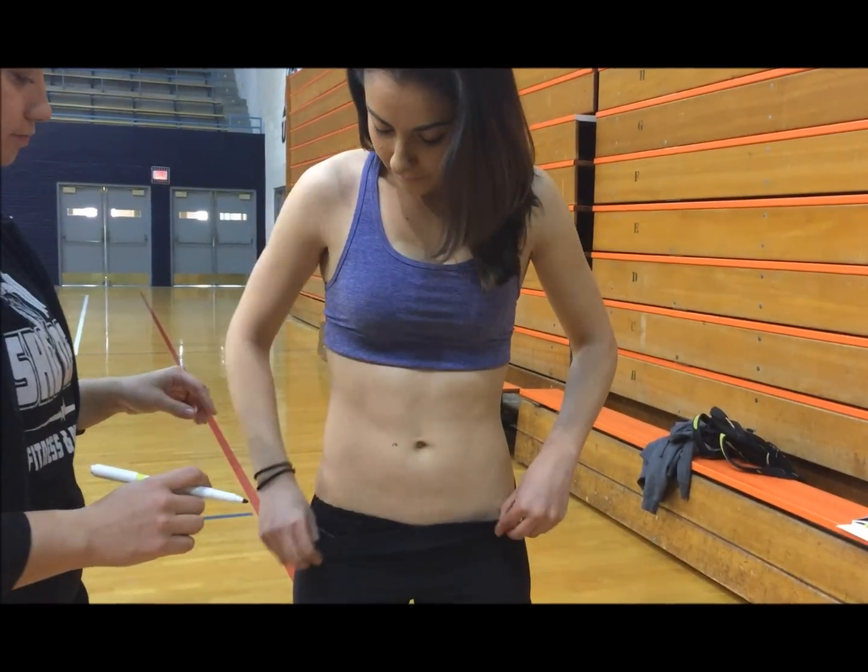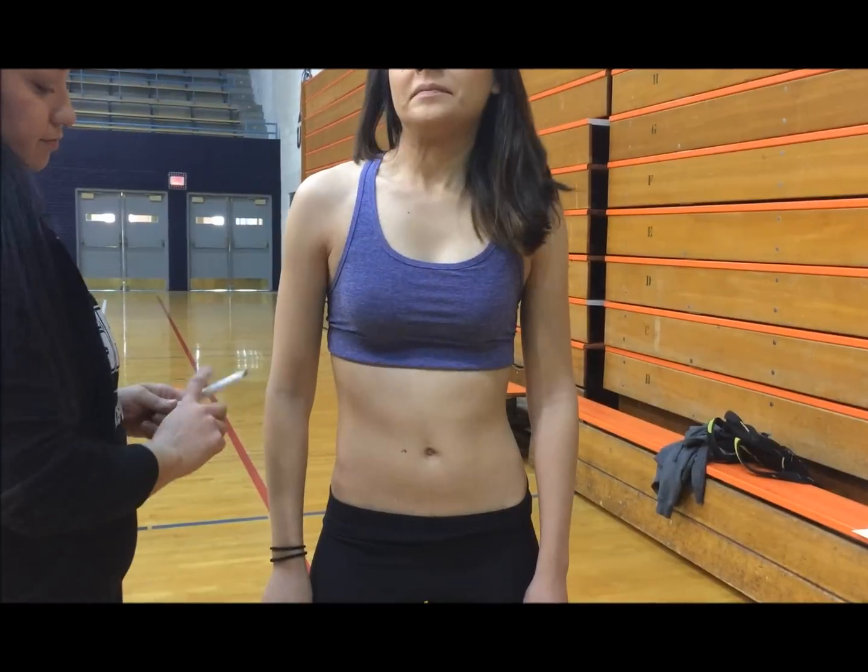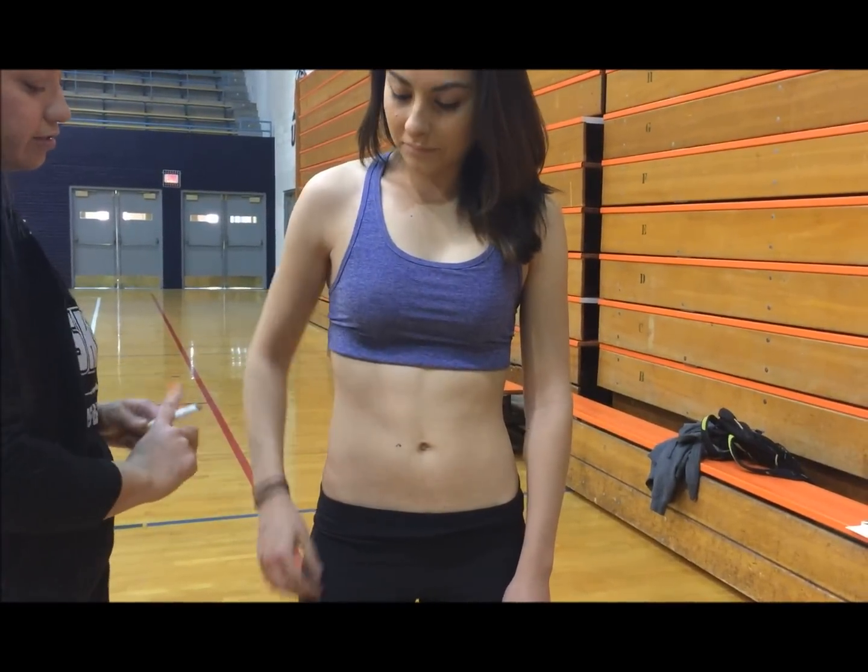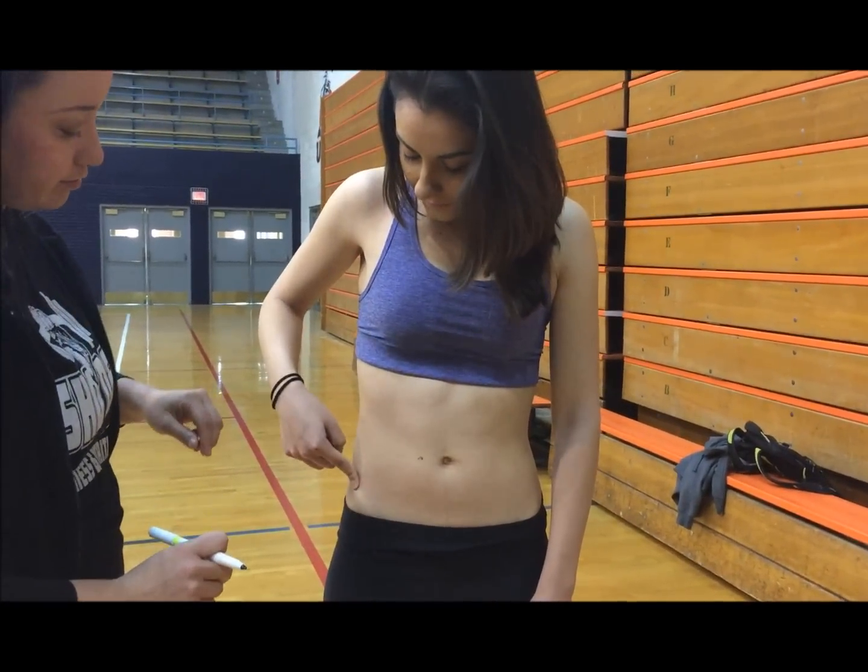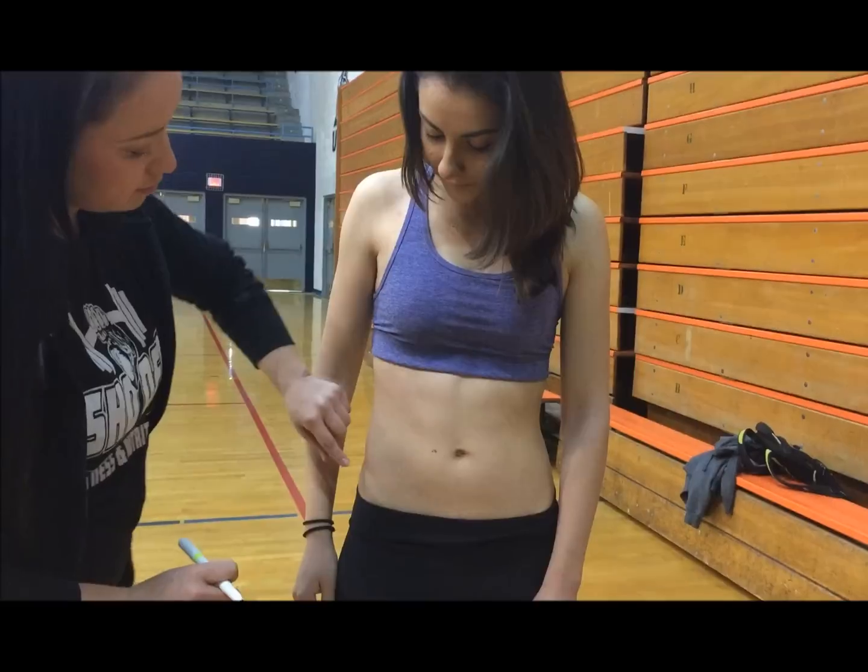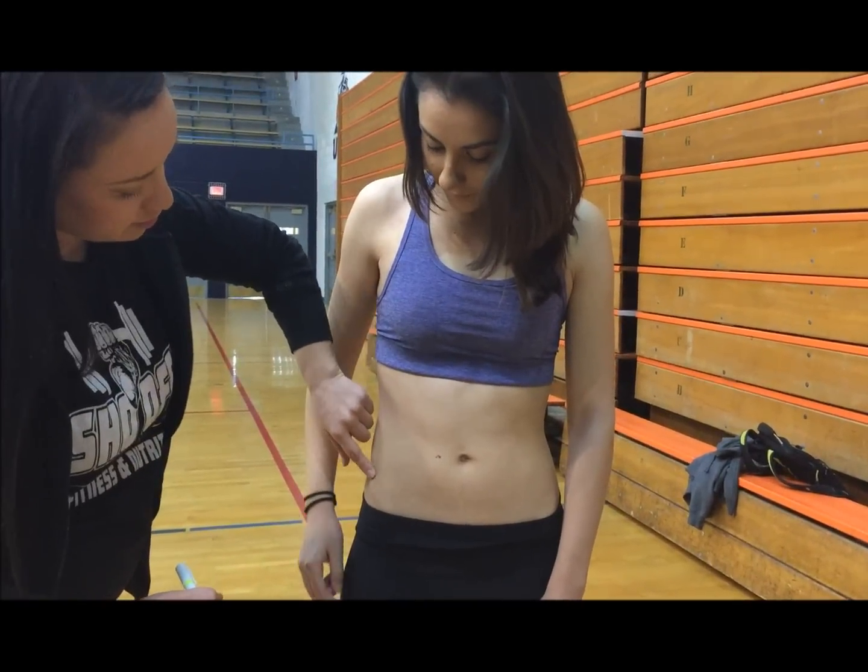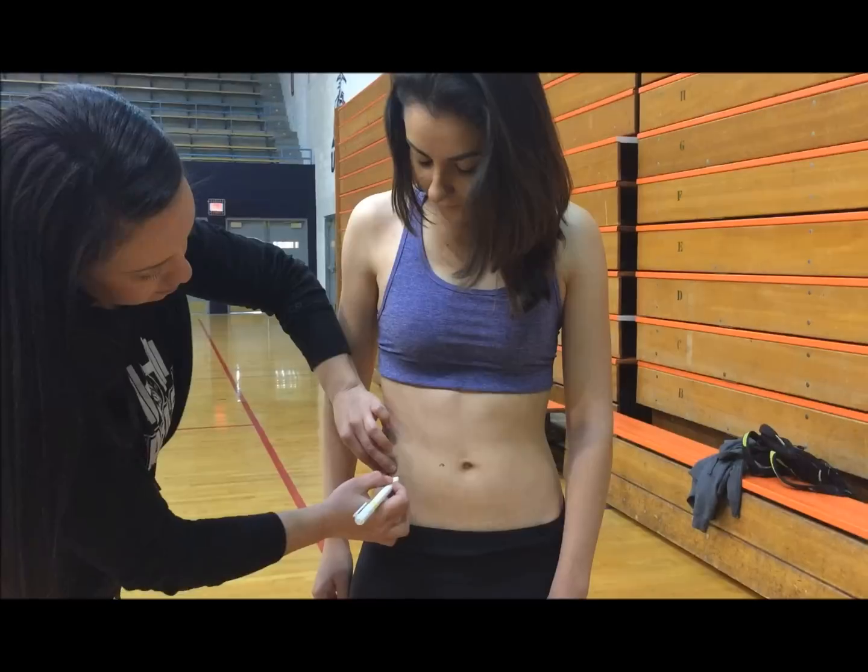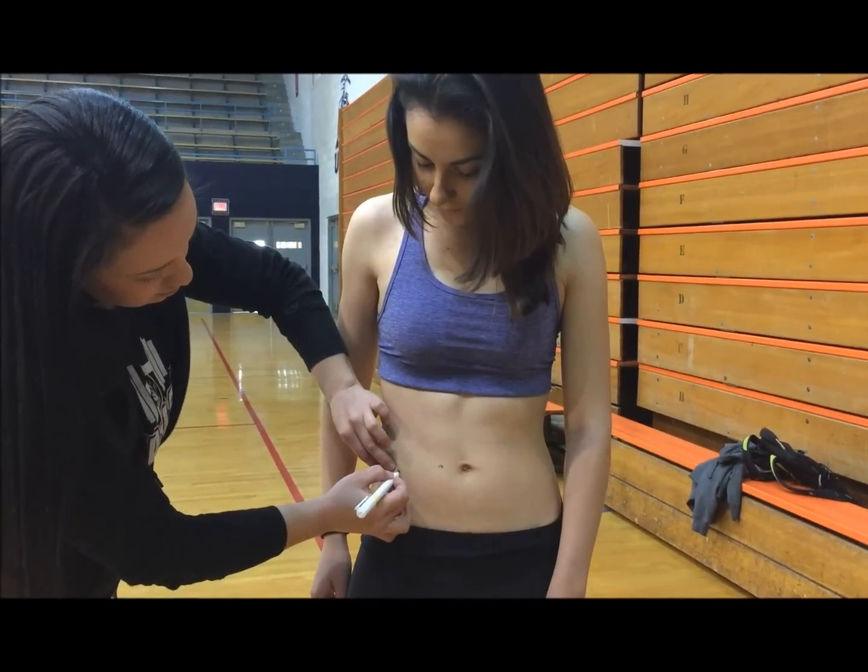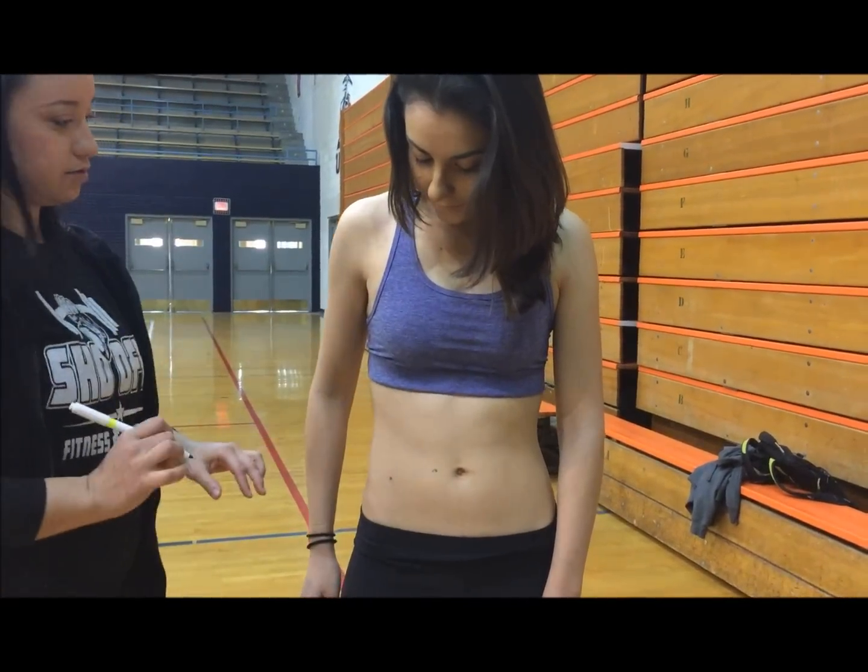Next is the suprailiac. Make sure that it is right by the hip bone. You can have the subject point out their hip bone if that is more comfortable for them. It is the anterior axillary line, immediately superior to the iliac crest, in line with the natural angle of the iliac crest.